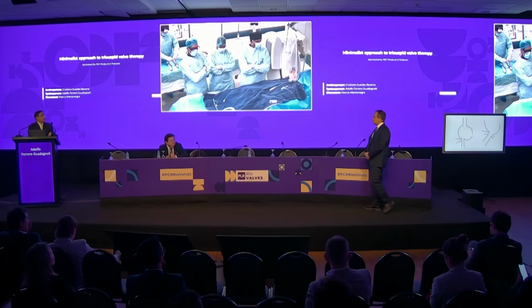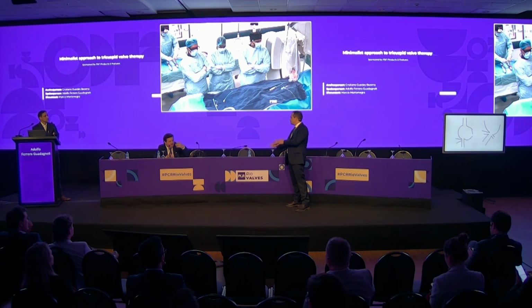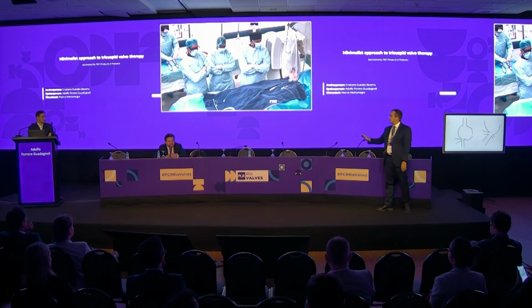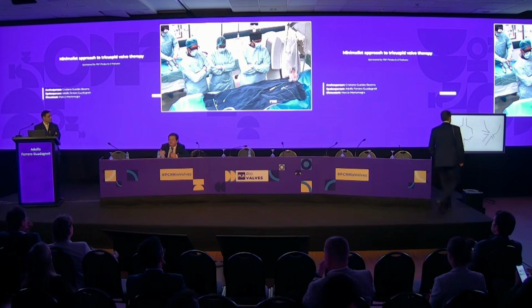Yes, and we are all concerned about the RV function. So if you close the tricuspid valve, probably you have RV failure after the implant. And if you have the right atrium like a compliance chamber, you have more chance in the postoperative period. So yes, because with this kind of solution, you have a right atrium like a reservoir. Yes. So what we thought in the past, that the ventricularization of the atrium was bad, is not too bad. It could be good for the patient. So, yeah, the more ventricularization you have, the better the ventricle is.